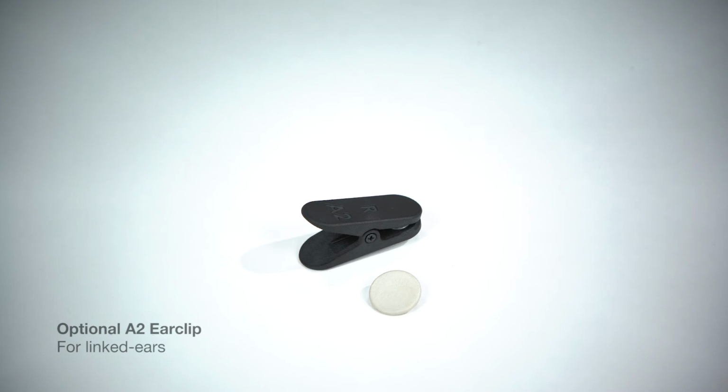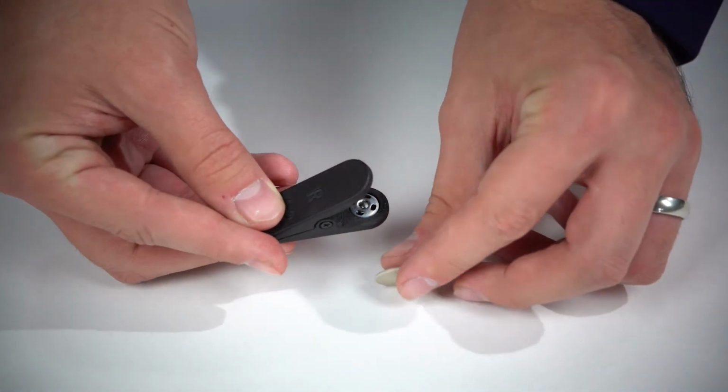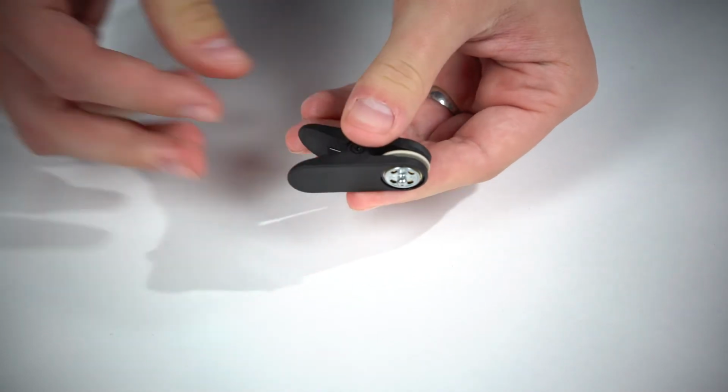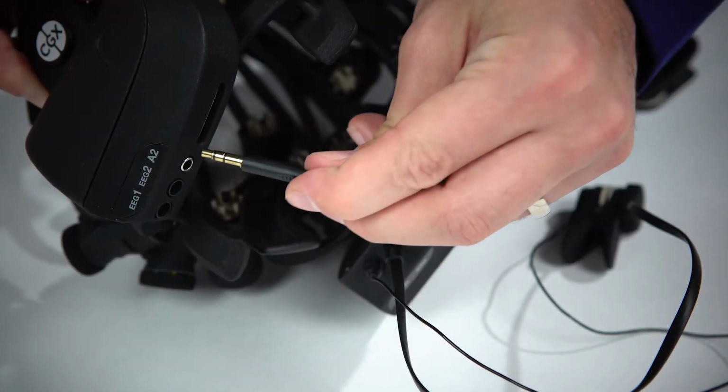Use the optional A2 ear clip for recordings that need A2, like linked ear sessions. The A2 ear clip has a single snap connector. Attach a DryPad ear sensor, then attach the active lead wire to the A2 handle.